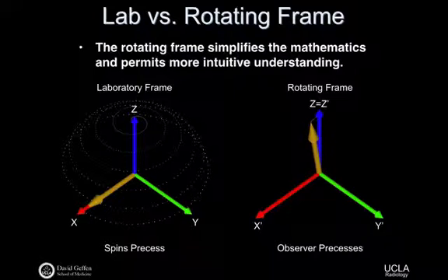In the rotating frame, that same RF pulse just maps out this. Much more simple, much easier to understand. When I say this is a 90-degree pulse, you might say, okay, I'll take your word for it. Here, it's much more clear that it's a 90-degree pulse. We've acted on the spin system such that it rotates a total of 90 degrees. The interesting thing is that how far it rotates is something we can control. And in fact, the direction that it rotates is something we can control.